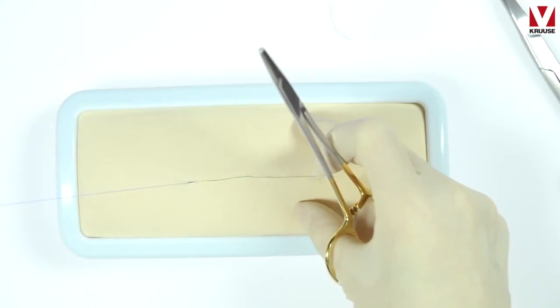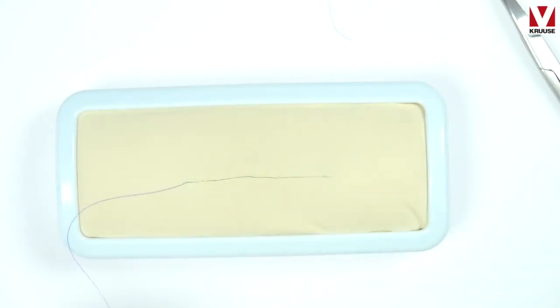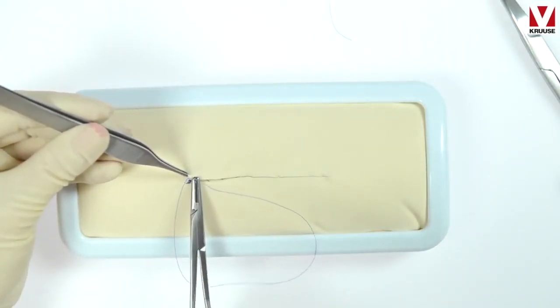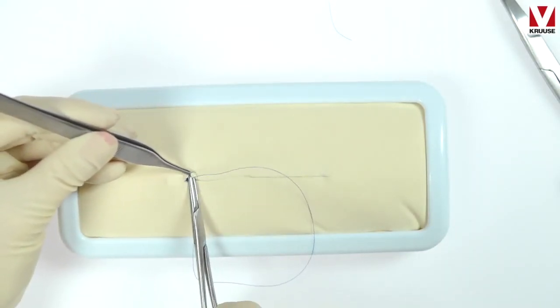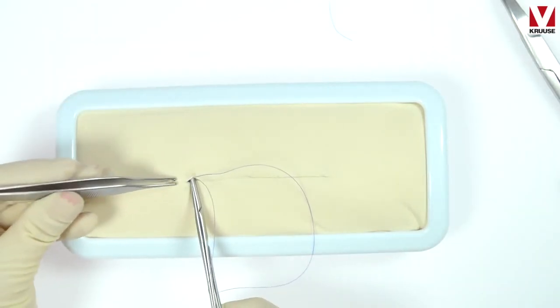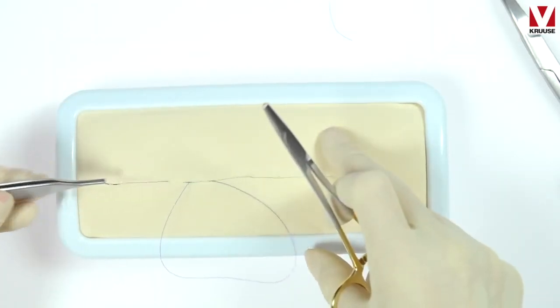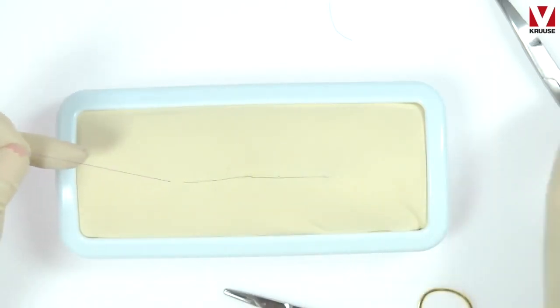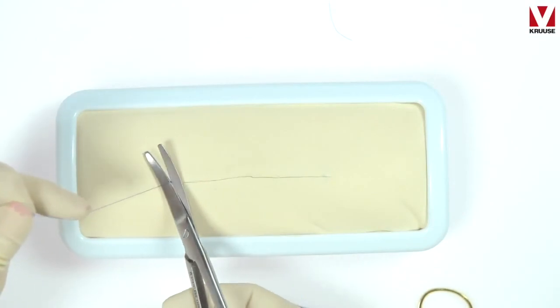Then I load the needle holder with my needle again. And I go behind the knot that is buried. And I am careful not to touch or damage the suture with my needle. I go up one centimeter from the incision, tighten it, take my suturing scissor and cut.